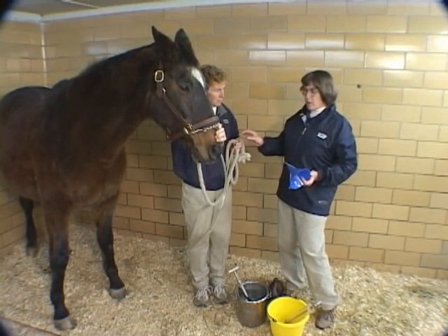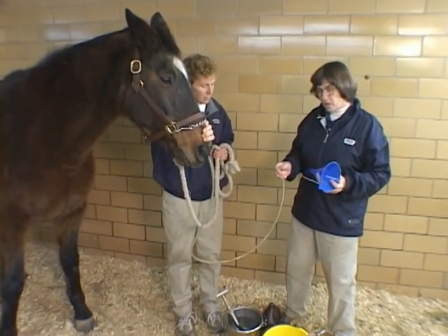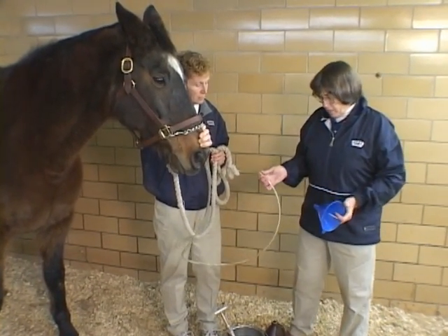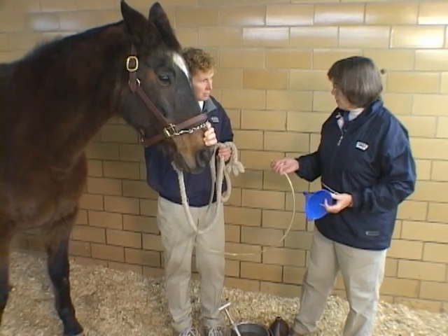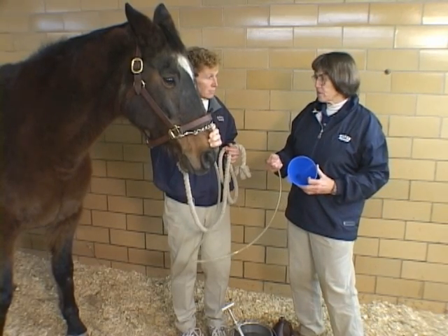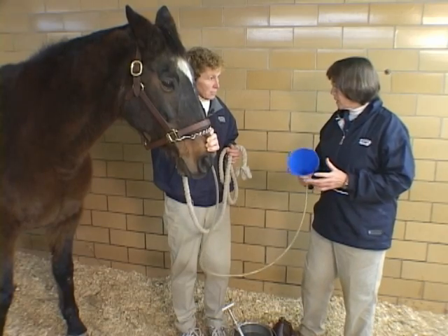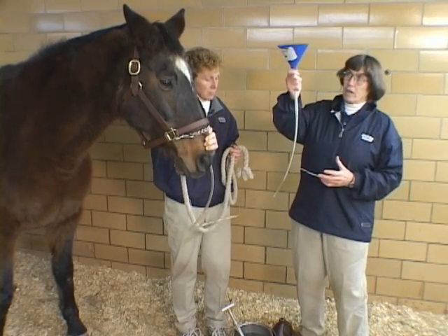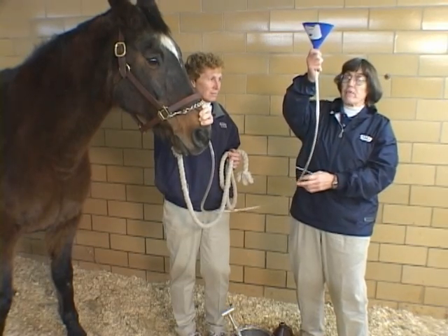We have Leroy here and you can see he's relatively comfortable with the tube in his nose. Talking about some of the medications we might be giving — if I was giving a relatively small amount of medication, like old-fashioned worm medicines, a lot of times we would give this by gravity flow: just pour in here and let it run down the tube by gravity.